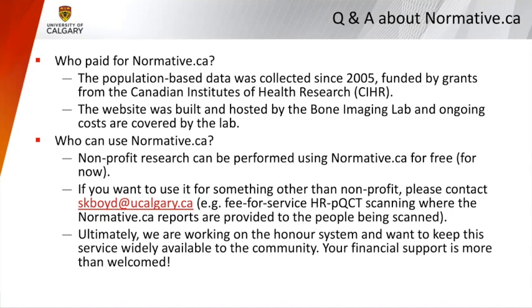Who can use normative.ca? The idea is it can be used for nonprofit research. So you can use it for free. If you do want to use it for something not nonprofit, so if you're, for example, doing fee-for-service work where you give an XtremeCT scan result to a patient of yours and you've charged them for it, then I'd like to know about that, and we can talk about how to make normative available to you as well.